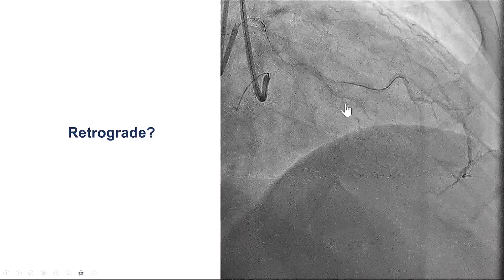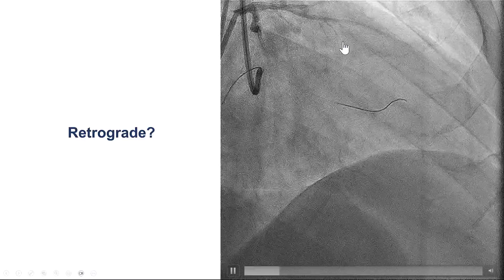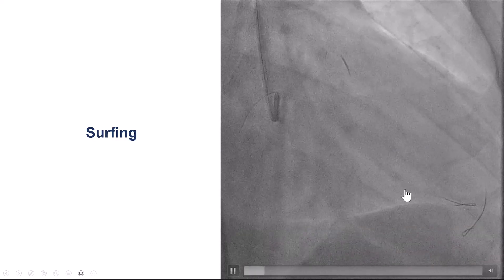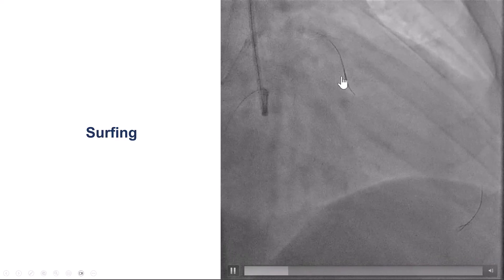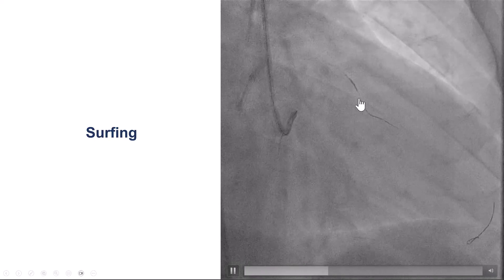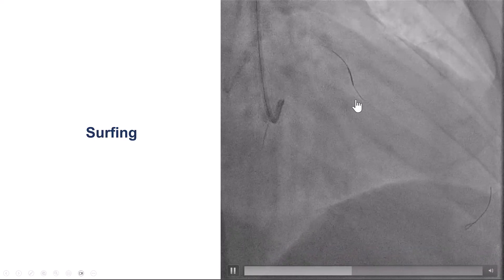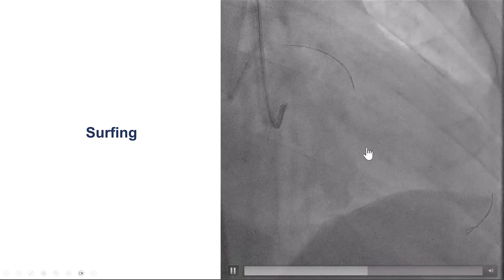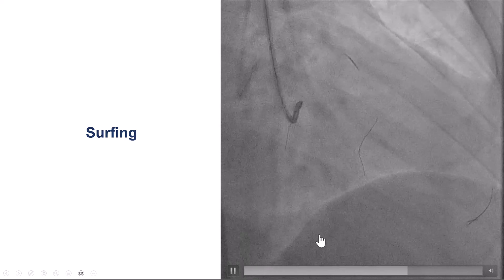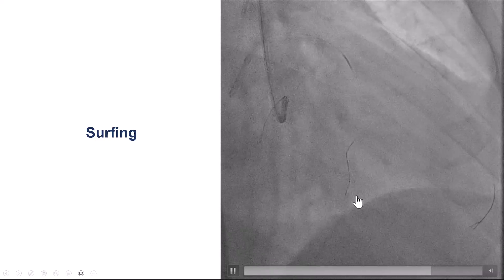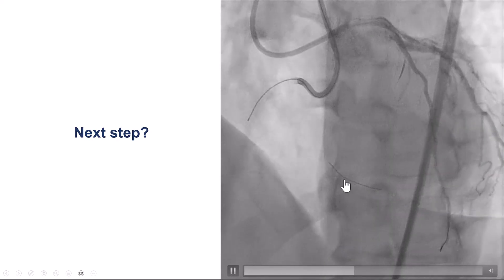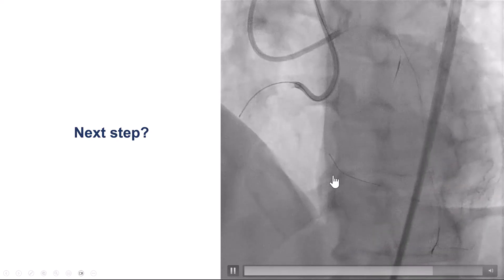As planned, we decided to go retrograde, even though we did not see a continuous connection from the LAD to the PDA. We did surfing using a SUO 3. We are pulling back and redirecting. We also used a Sion Black, which can sometimes be very useful at CC0 collaterals that don't have a visible connection. The wire seemed to enter some sort of septal and turn around, but when we did the injection, the wire was clearly not in the PDA — it was somewhere in the septum.